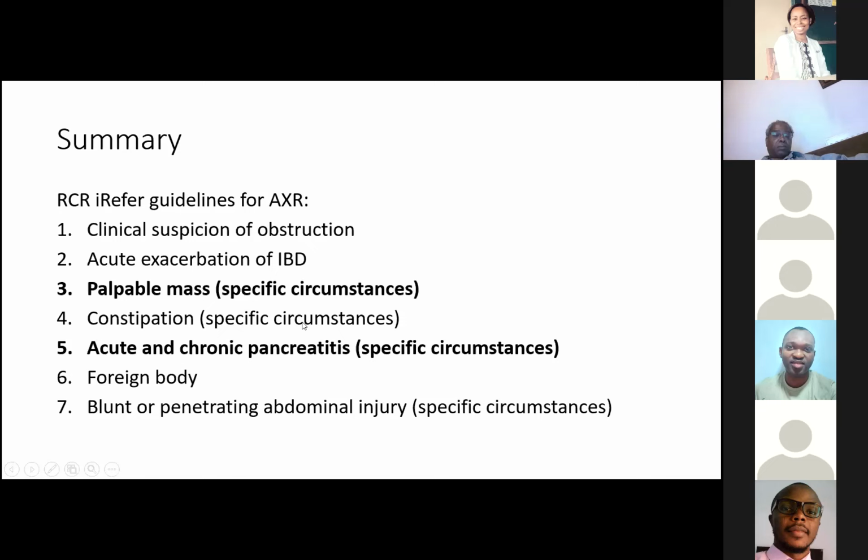The one I'm most worried about is the normal X-ray, more so than the abnormal X-ray. Don't put too much faith in an apparently normal X-ray, because if you've got bowel distension and bowel obstruction, everybody is pretty clear that maybe we should refer the patient on to the next big hospital in the region, which might have a surgeon, and in some cases people will be happy to operate on the basis of the clinical scenario and the X-ray.